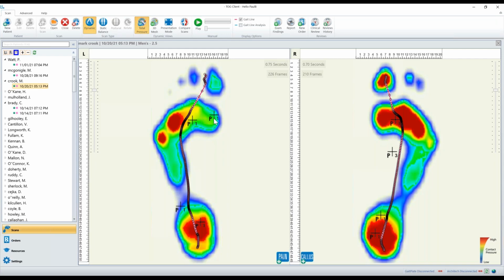So again, we want to test to see, is this a first metatarsal limited, anatomically limited position? Or is it a rigid first MTP joint? Or is it just a painful first MTP joint? Or, most commonly, it's a hypermobile first ray, which hits the ground, elevates, and then doesn't want to work anymore. So it has to offload.